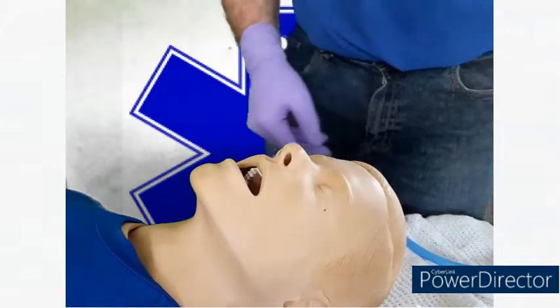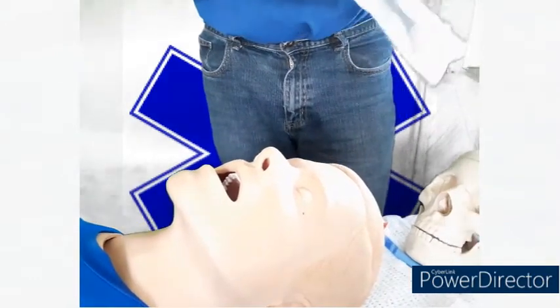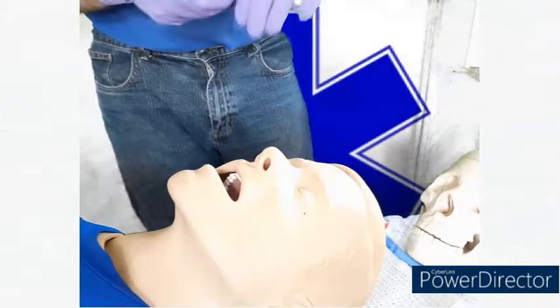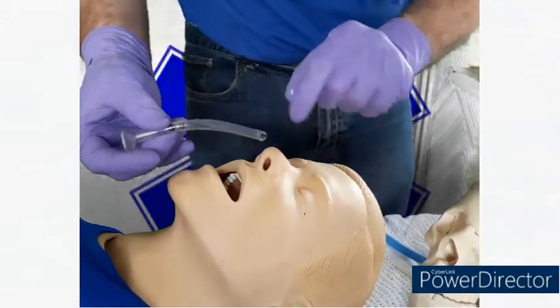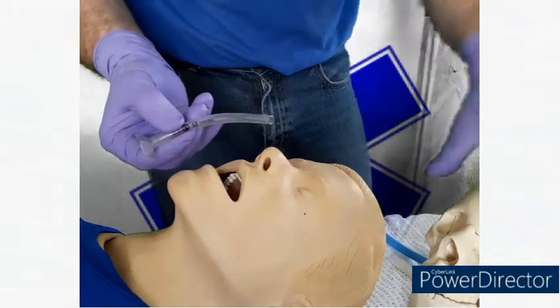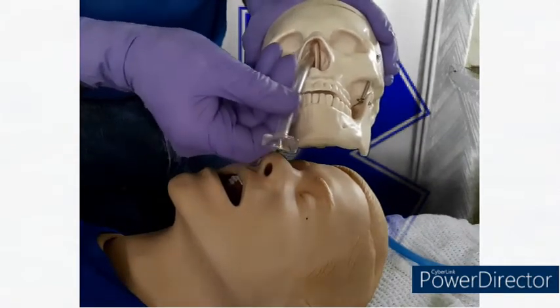Now, we do want to avoid a couple of things with the nasal pharyngeals. And I'm just going to get a smaller size out to demonstrate this. So if we think our patient has got a base of skull fracture, then we're going to avoid using a nasal pharyngeal. But the other thing is, when we introduce the nasal pharyngeal, it starts going up the nose, and lots of people think we should carry on pushing up. That's not the case, because if we look up the nose, it kind of stops. So if I was pushing it directly up, it wouldn't go anywhere.